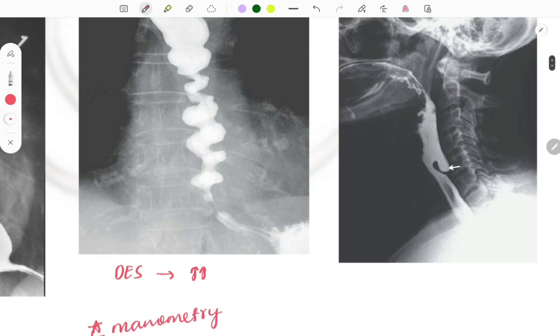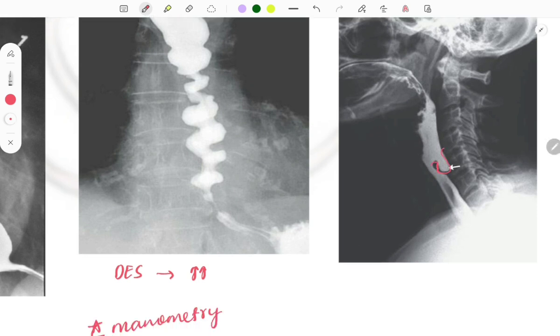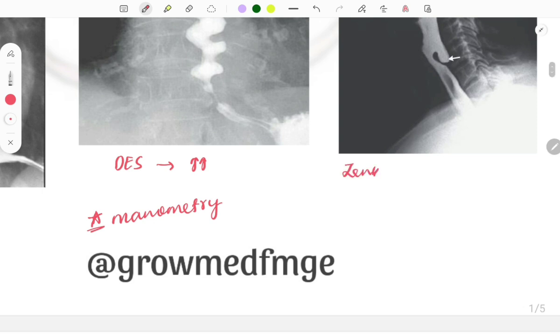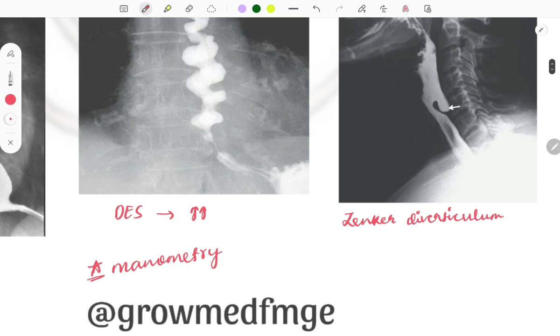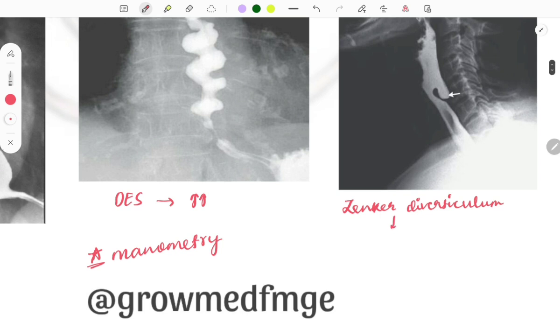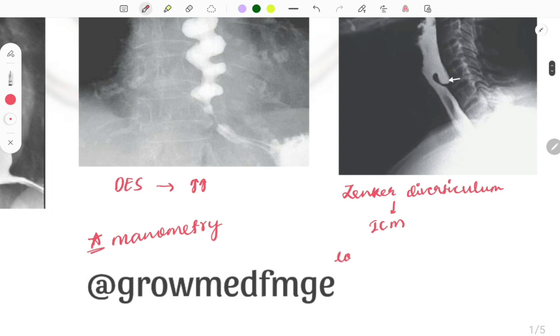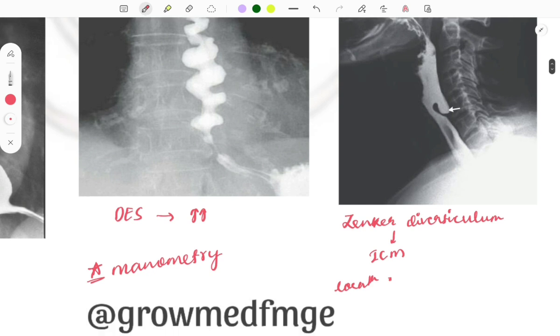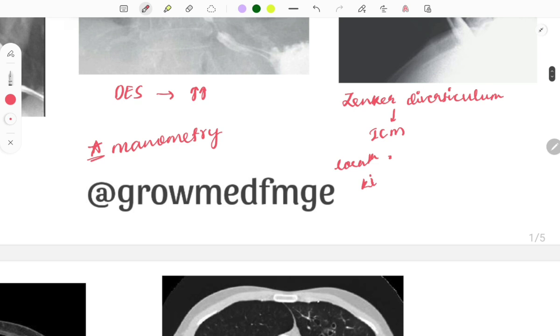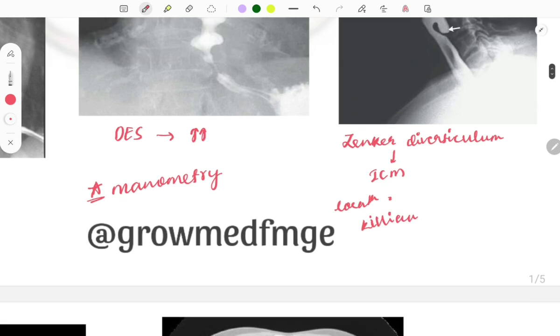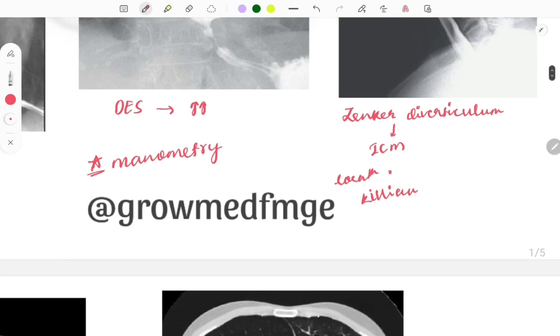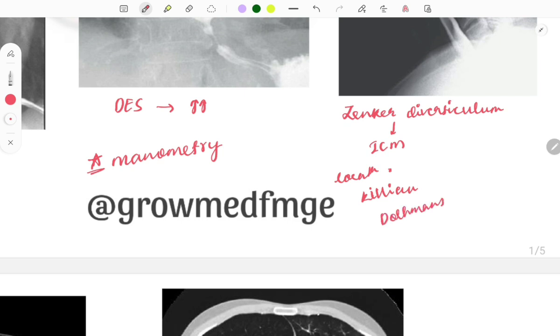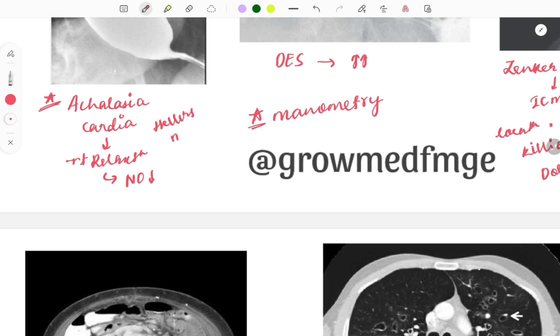This image is of Zenker's diverticulum — you can see an esophageal pouch forming. It occurs due to weakness between the inferior constrictor muscles, specifically between the thyropharyngeus and cricopharyngeus — the location known as Killian's triangle or Killian's dehiscence. Treatment is Dohlman's procedure. For achalasia cardia, the treatment is Heller's myotomy — note this distinction.